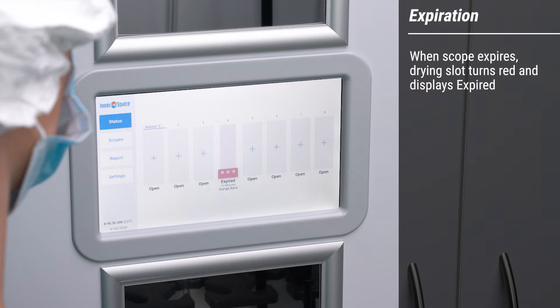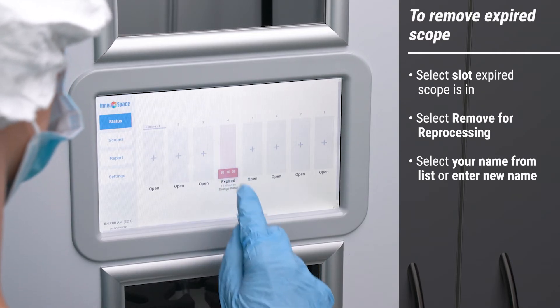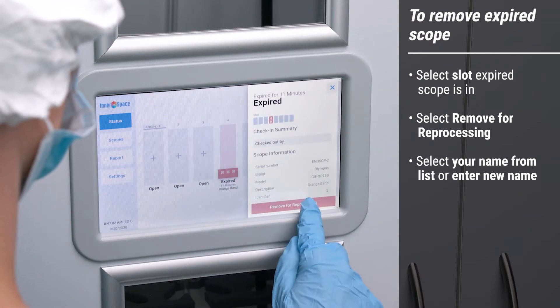Once a scope is expired, it needs to be removed from the cabinet and reprocessed. The default expiration is 7 days, but it can be changed in settings. To remove a scope for reprocessing, select the slot the expired scope is in and select Remove for reprocessing.